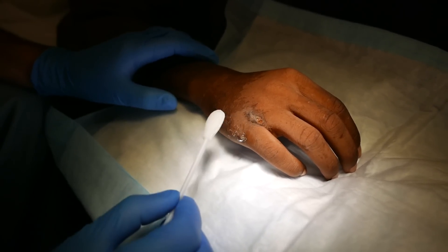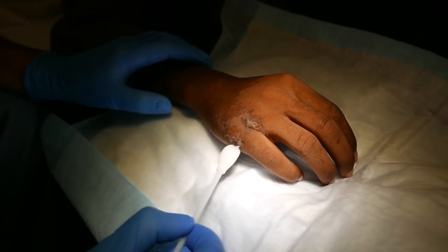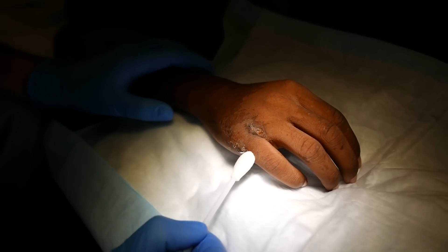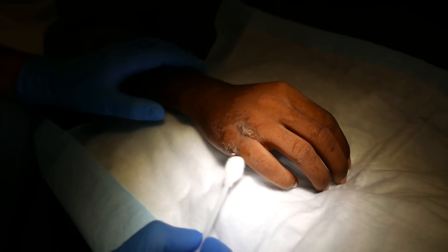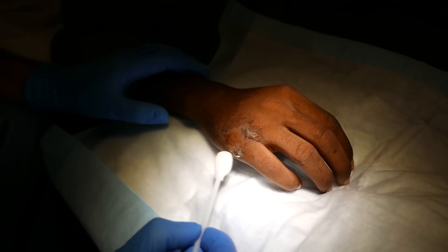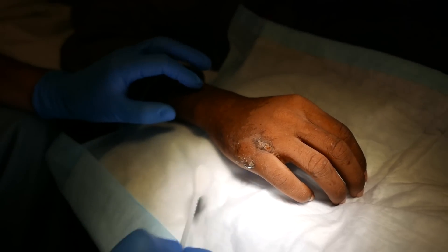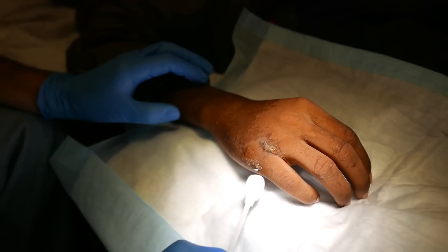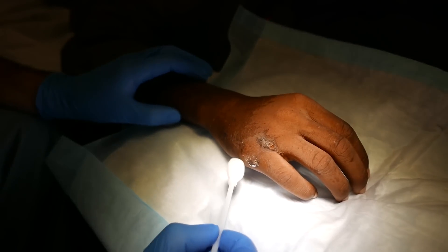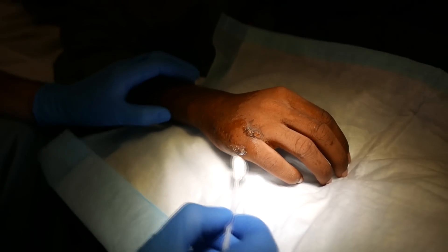K-wires have been in use for quite a long time, first popularized by Dr. Kirchner — hence the 'K' in K-wire — around the year 1909. They're very commonly used in orthopedic surgery and in veterinary surgery. Essentially it's a sharpened pin, sharpened down at the point that goes into the bone, and they're used for internal fixation of fractures and bone fragments.